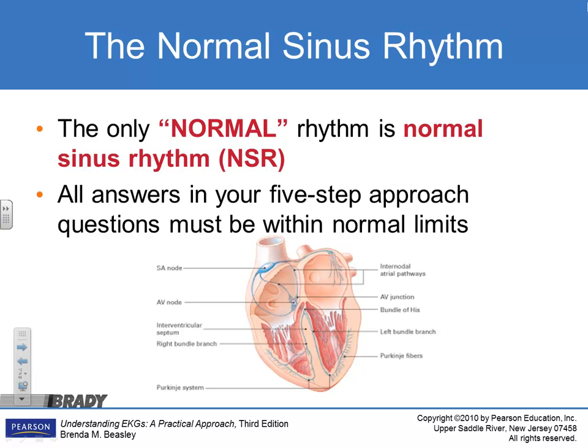So if you have any ectopy, you know what ectopy is? Any funny little beats in there, any strange things that don't fit with your normal sinus rhythm. Say you go along, you've got 50 beats, and then you have a QRS, a PVC or something, and then it picks right back up. You would call that a normal sinus rhythm with PVCs.